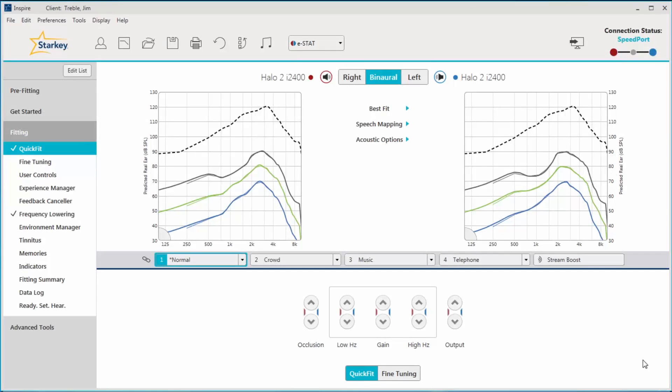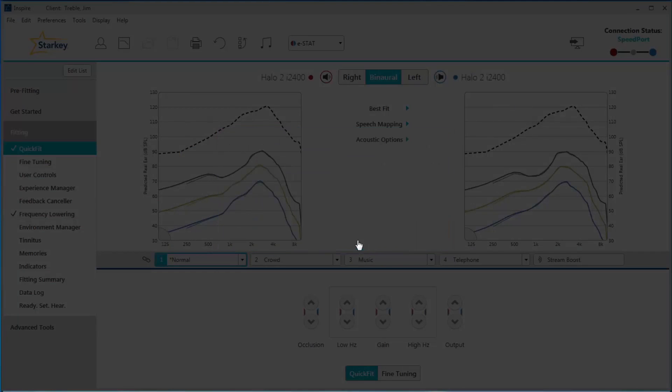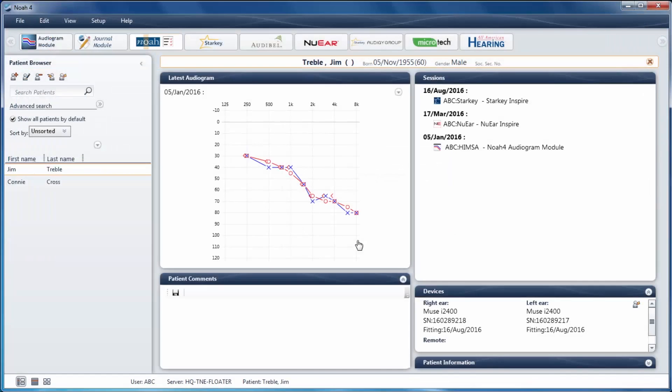After you finish programming the patient's Halo devices, be sure to close Inspire. Then open and close the hearing aid battery doors. This ensures that the hearing aids are disconnected from Inspire and the TruLink programmer.